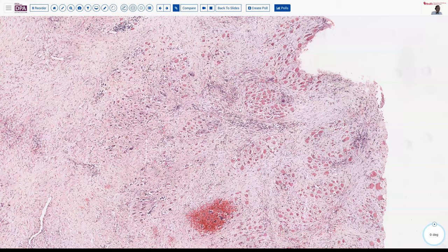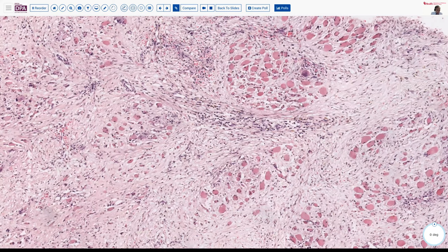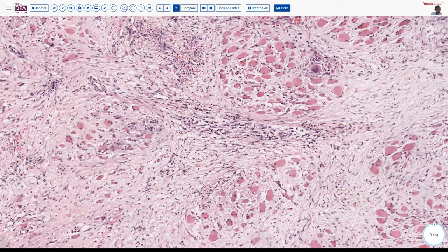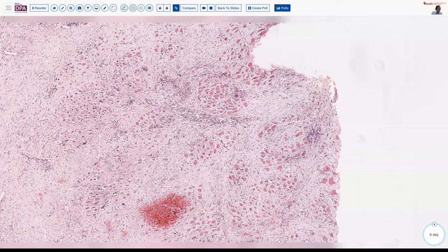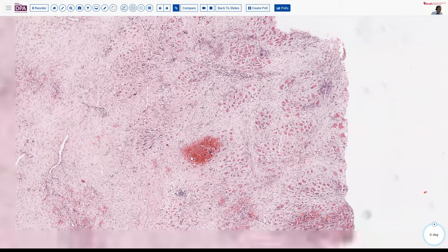So that's one feature that we can use to differentiate rhabdomyosarcoma, the nodular architecture of the degenerating cells. Multinucleation is another feature which will give you a clue. As you look at several of these, you see some of them have two or three nuclei, and they tend to be peripheral. And that's what happens to skeletal muscle fibers as they've been denervated or otherwise altered, the nuclei remain in the cell. The nuclei are not degenerated. It's only the cytoplasm that's lost. And so the nuclei remain, and you get multinucleate bizarre cells. The other feature here is that the surrounding tissue is a fairly bland fibroblastic tissue.